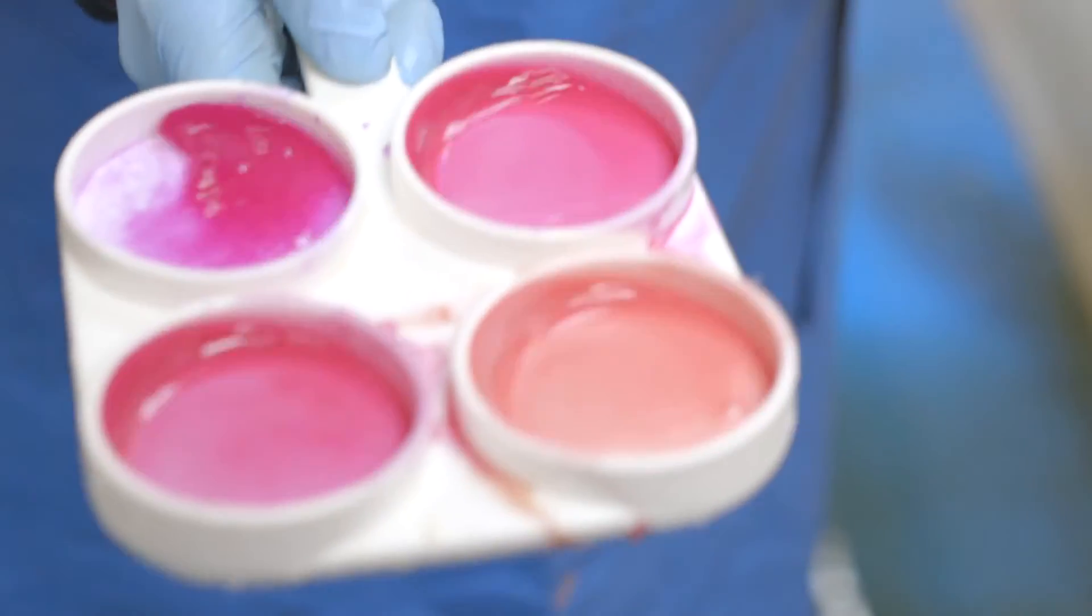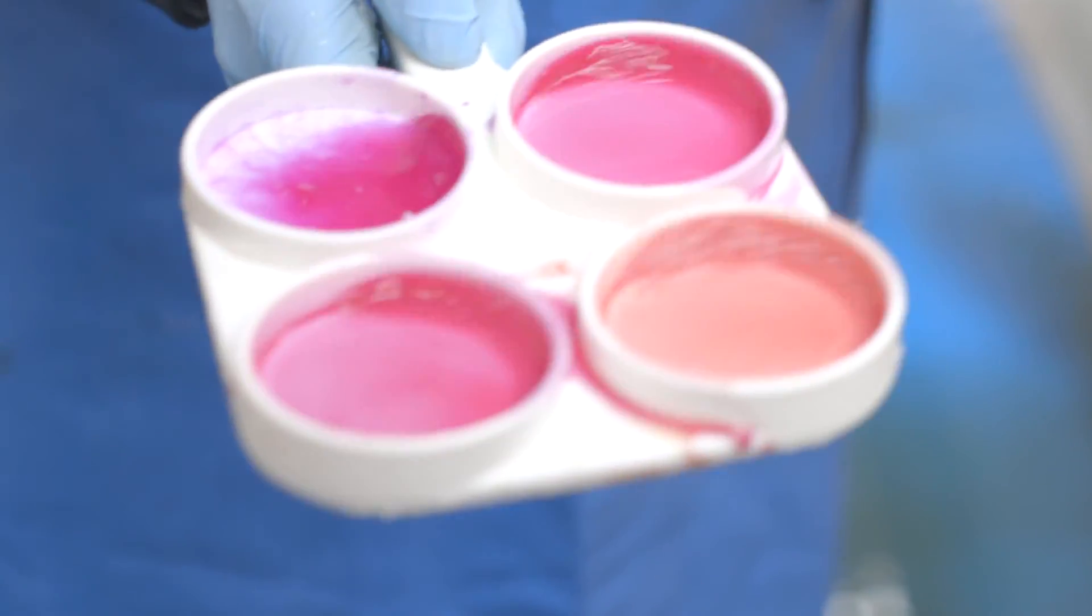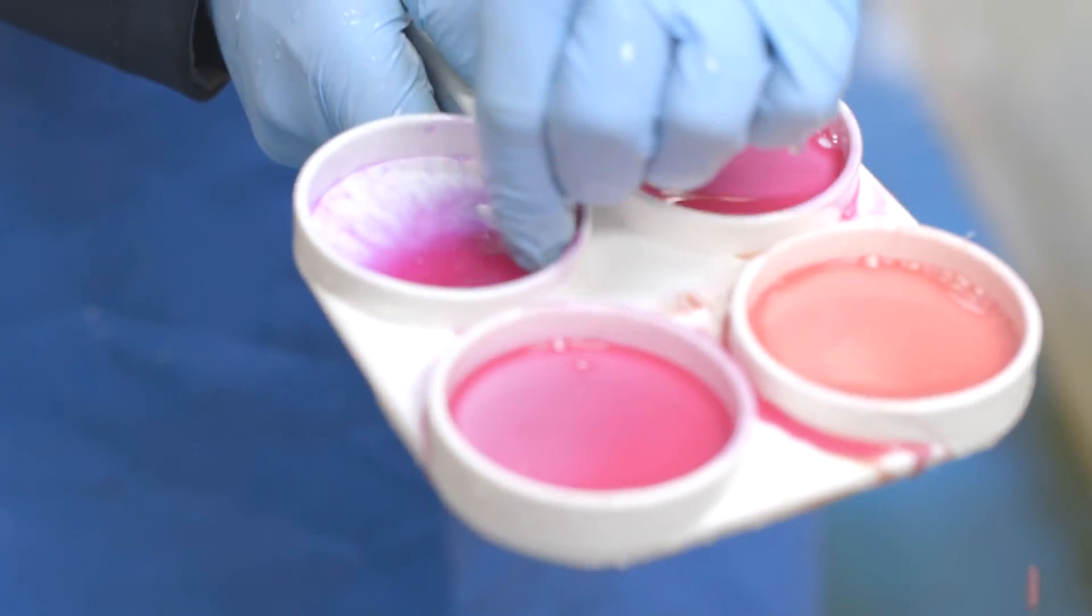High somatic cell count milk will cause a thickening of the mixture, and with a strong positive result it will thicken to a gel.